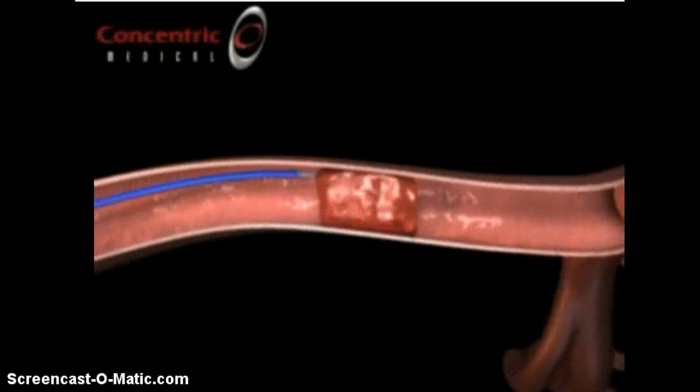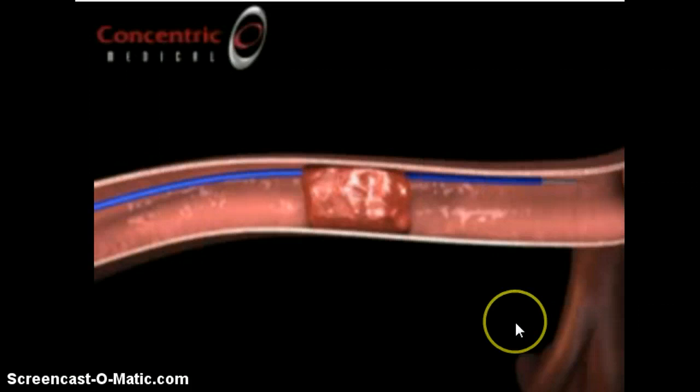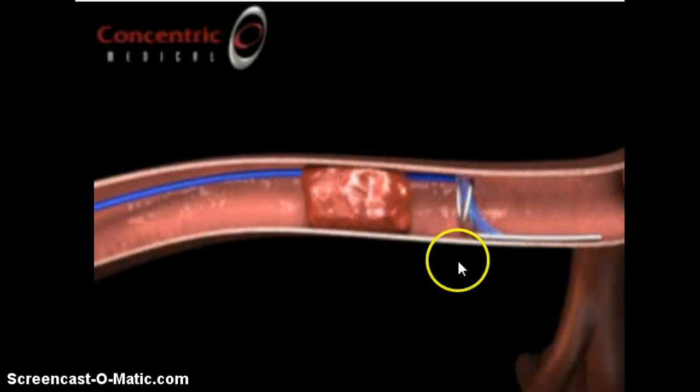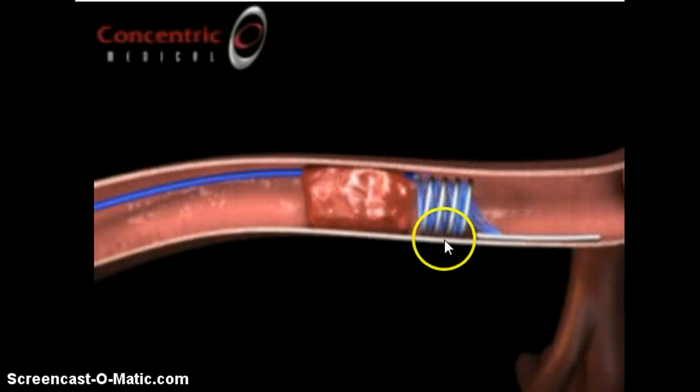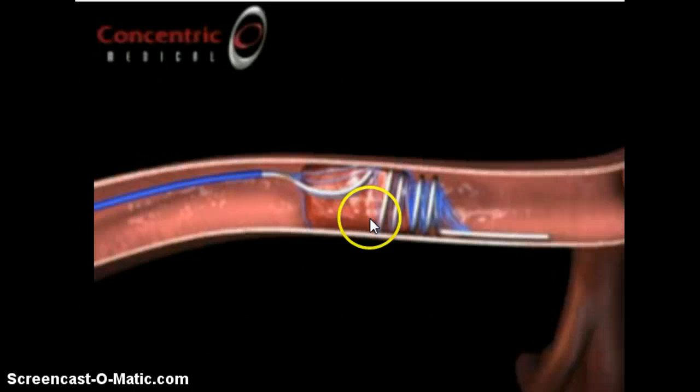Here's a video found on YouTube that would fall under the other category. They've got this wire going through, then they remove the catheter, and look what the wire does — it coils, forming a shape where it can catch the thrombus and pull it out.